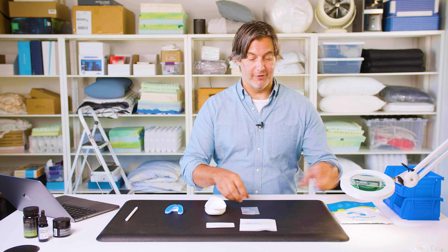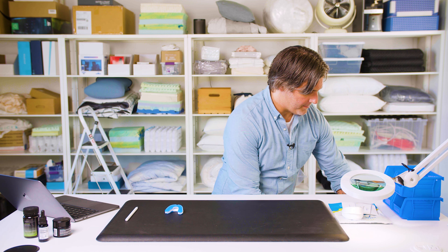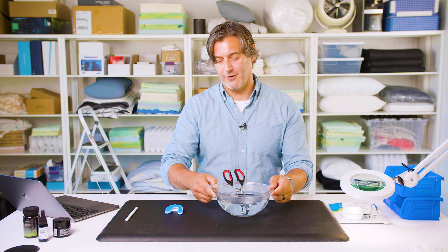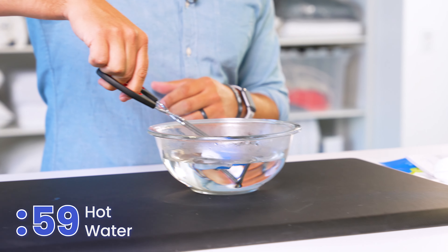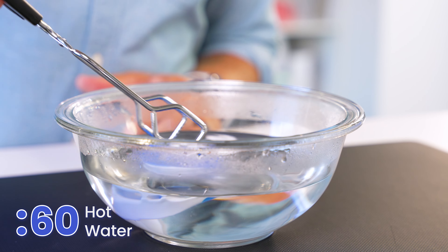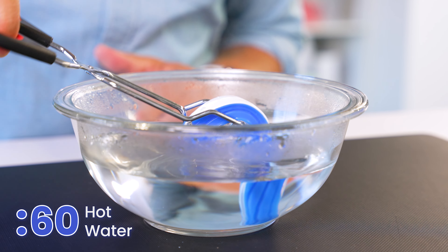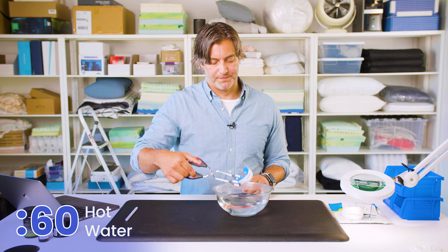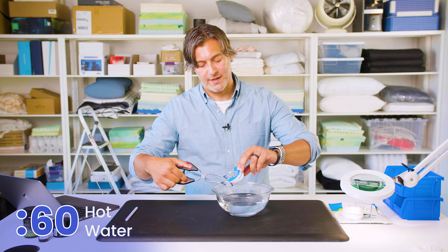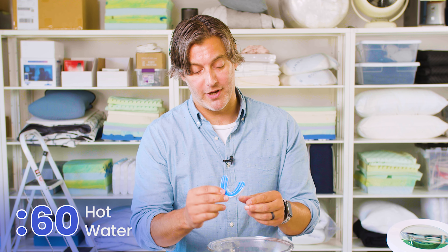Before your first use, you're actually going to want to place it in really hot water. The manufacturer recommends 170 degrees Fahrenheit. So you're going to place this in really hot water for about 60 seconds. One thing I'm noticing is that this mouthpiece does not fully submerge, so as you are keeping it in this hot water for 60 seconds, you may need to hold it underwater. About a minute has elapsed — go ahead and take this out. At this point, if your water is 170 degrees or warmer, you're going to want to make sure to cool this off before you actually place it in your mouth. 170 degrees on your mouth is not fun.